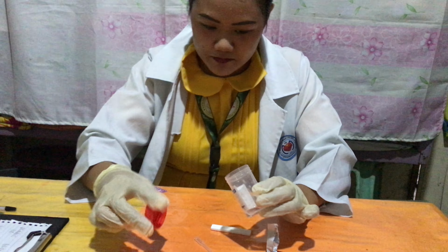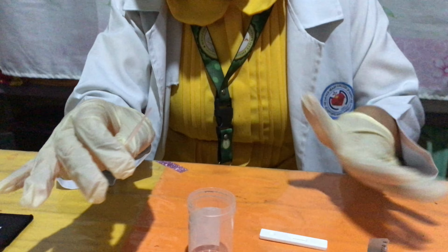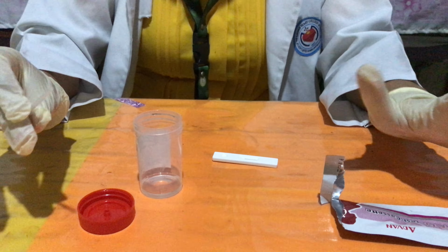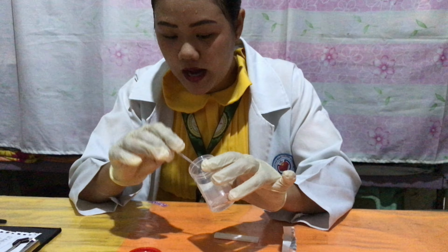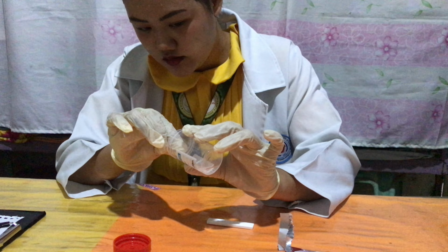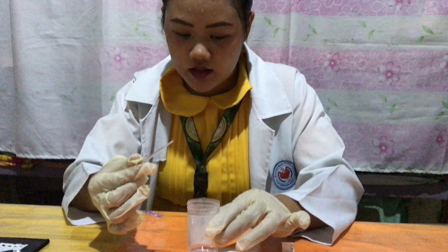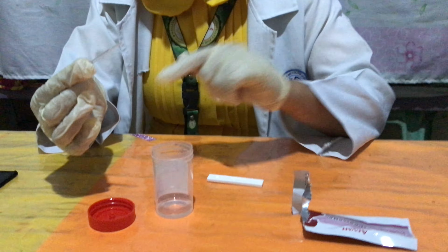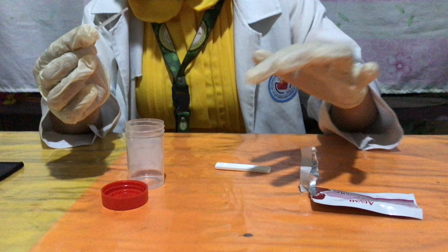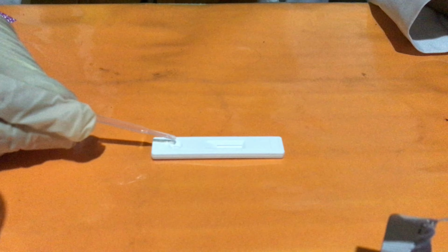We have here the specimen and the urine. After we open the tester kit and put it on the examination table, we will have to, using the dropper, aspirate some urine, just like that, from the sterile specimen container, and then put it on the indicator area.